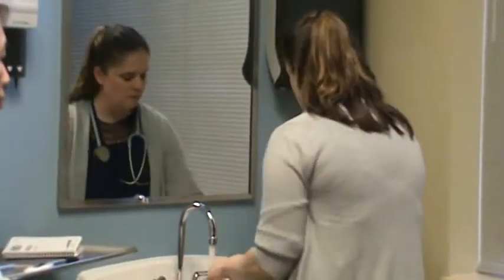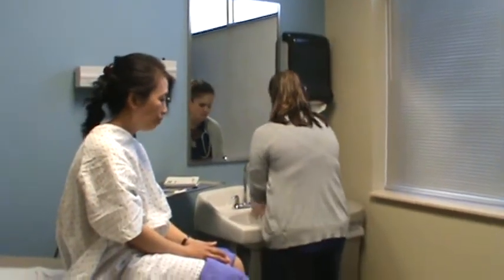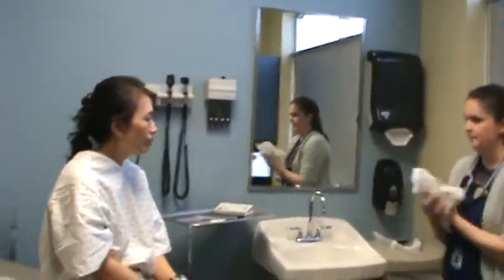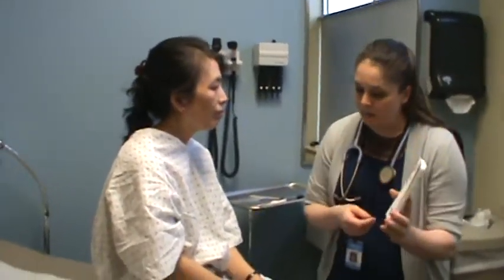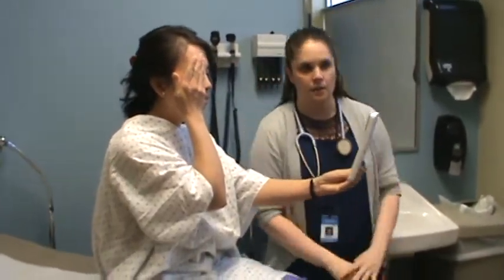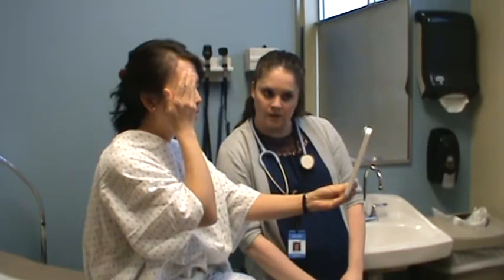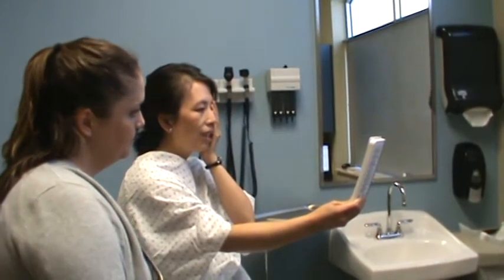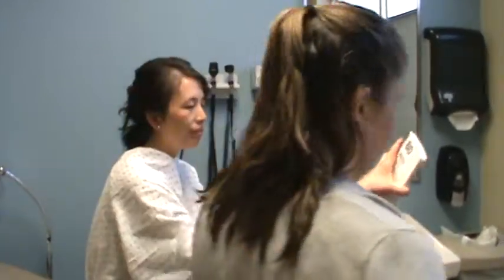I'm going to wash my hands here. Start by testing your vision here. I'm going to have you hold this vision chart up and cover one eye and read the lowest line that you can see. 574019. Okay, that's 20/40 on the left, and then we'll do the same thing on the right eye. 57401913. Okay, 20/40 on the right.